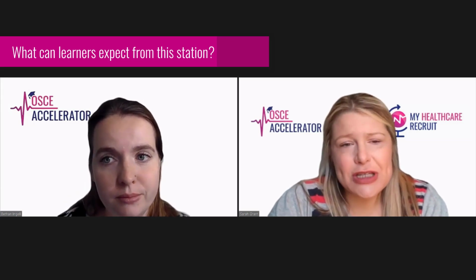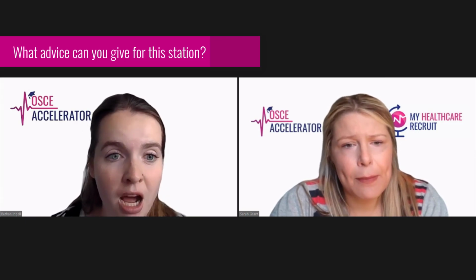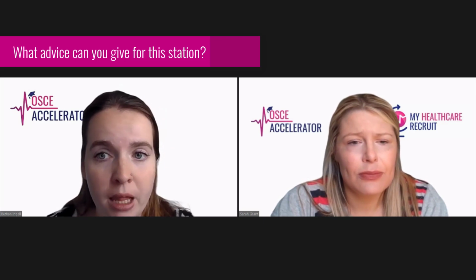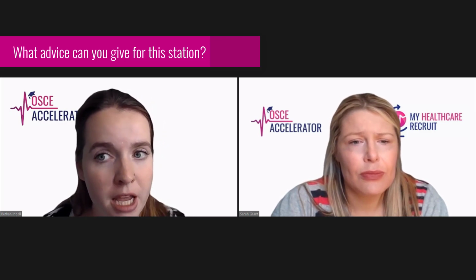Wonderful. What kind of advice are you expected to give at this station? According to the marking criteria, you need to say that they may experience some symptoms post-removal, which, as we know, is quite unlikely, but they like you to talk through it in the exam. These symptoms can be urgency, frequency, and discomfort. You also need to encourage the patient to exercise and to drink more. The guideline is 2.5 litres. And we need to ask the patient to let us know when they've passed urine.